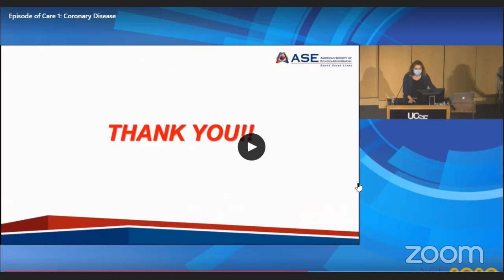Hasta ahorita donde vamos, no he llevado el tiempo en que han estado presentando. O sea, ¿cuánto tiempo después de que llegó el paciente? Parece que todavía le hicieron el eco transesofágico, el eco y la tomografía. Entonces, yo creo que nos van a presentar la angiografía que se ha de haber hecho, como decía el doctor García, ¿no? Salió un ecocardiograma pronto, rápido en el camino rumbo a la coronariografía, ¿no? ¿Verdad? Bueno, muy bien.